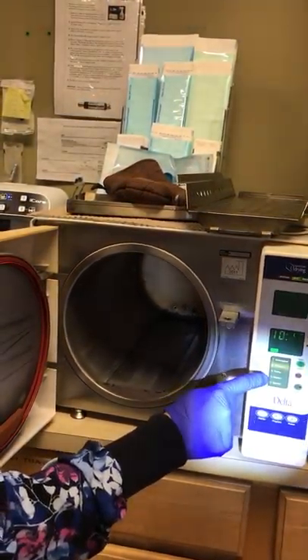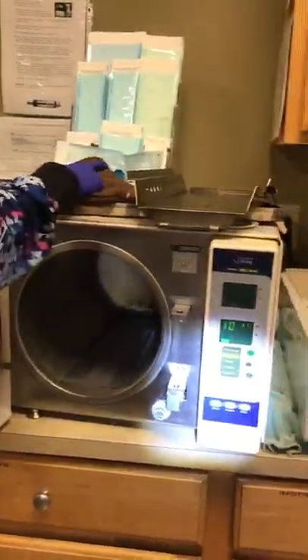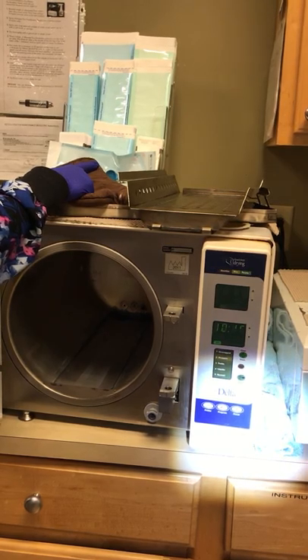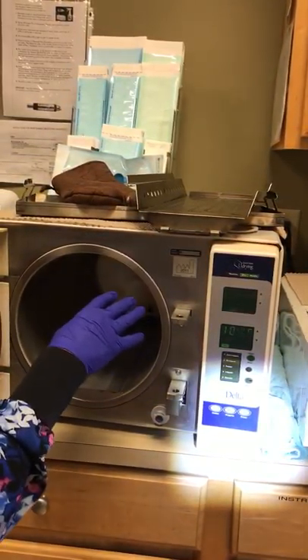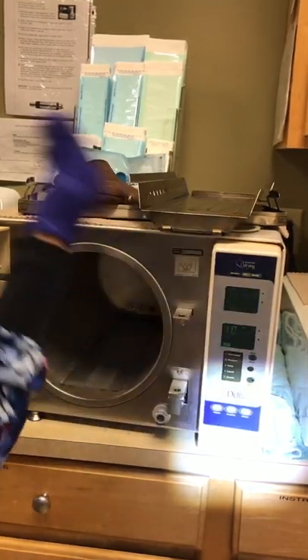Very important — you don't want to miss that, because if you run your instruments through on unwrapped, they're not going to be sterile. So you want to make sure you're back on unwrapped. Then put your water back in and it's ready to run.